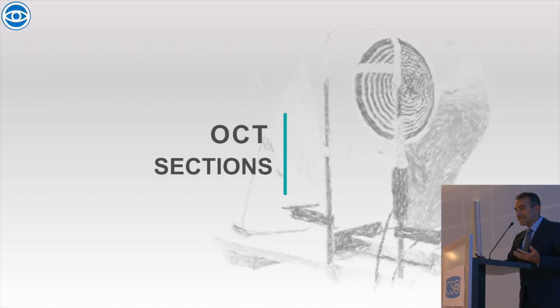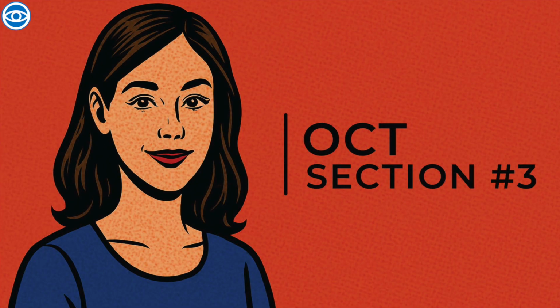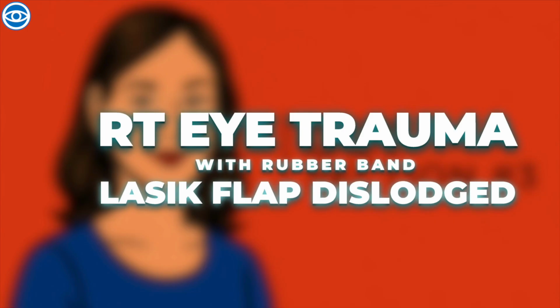And looking at OCT sections, I think that's so important. Professor Einstein showed us a lot of nice examples, Ivan as well. But I would like to discuss this nice example just to tell you that what Dan always says, that this is the slit lamp of the century. This is actually way better than my slit lamp, and I'll show you why.